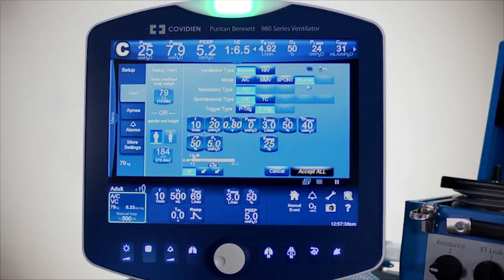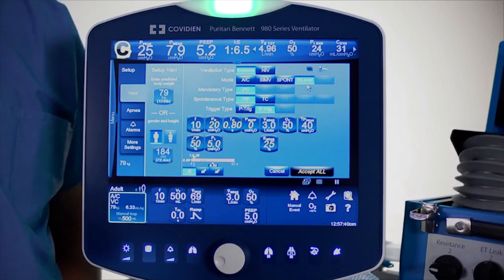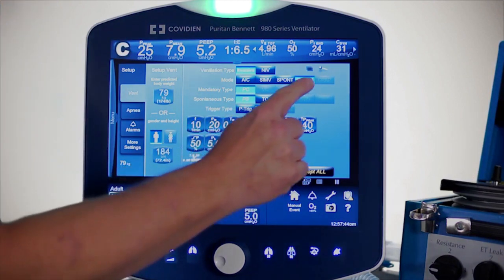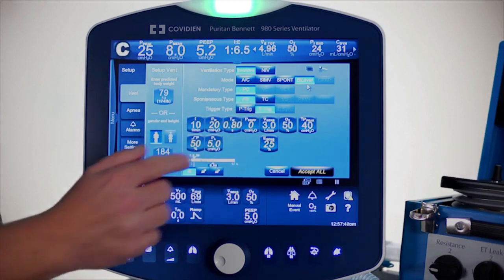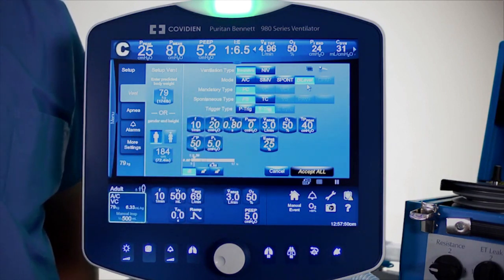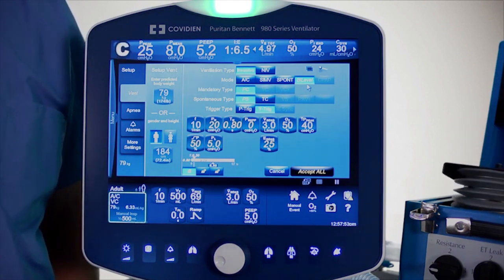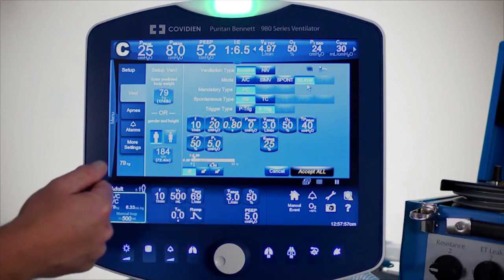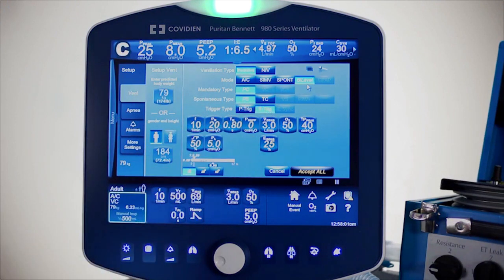The mandatory type is pressure control — there's no option there, so it really is an SIMV pressure control. You can also decide whether to support spontaneous breaths with pressure support, tube compensation, or nothing at all. Some pressure support will be added for now. You also have types of triggering: pressure and flow triggering.